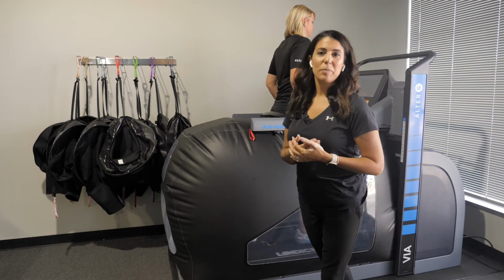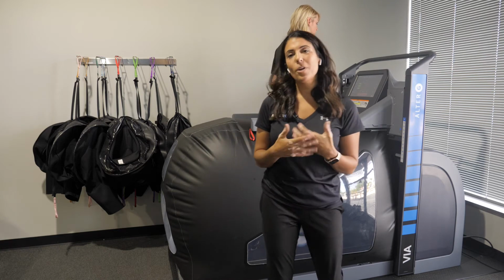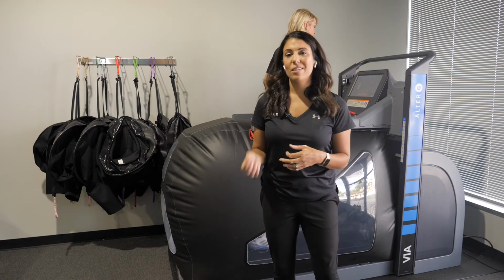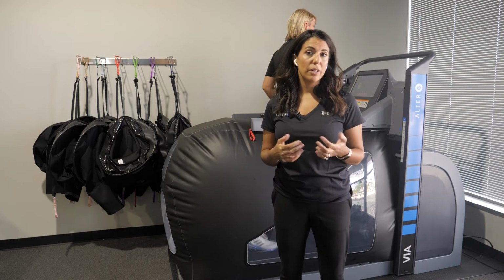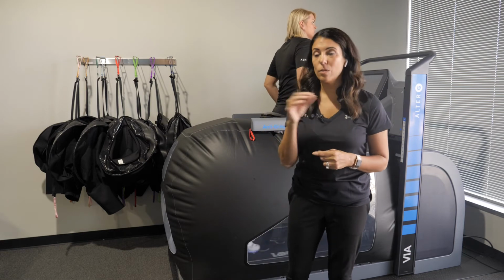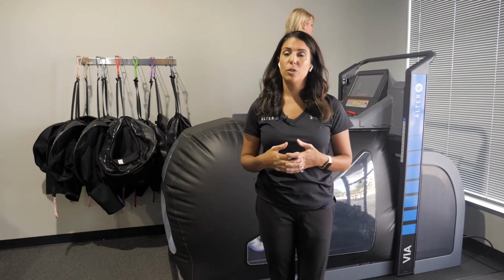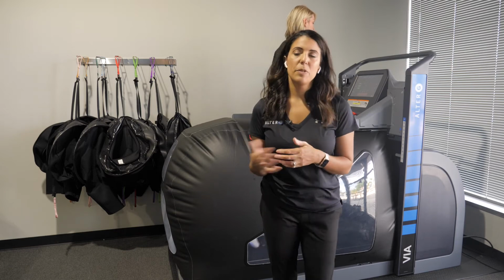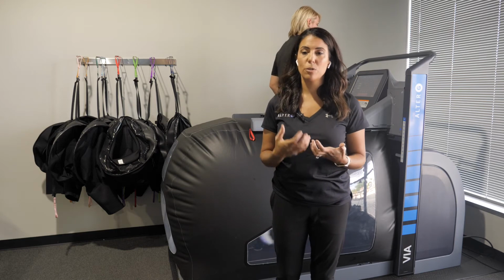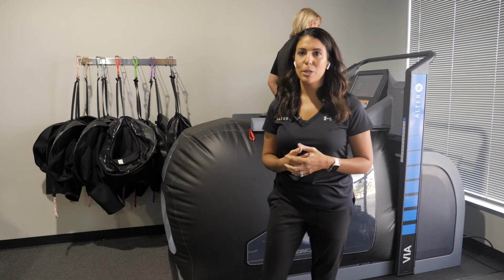I want to explain a little bit about StrideSmart software while we're talking about all the technology and features of the treadmill. StrideSmart is our gait analysis software that allows us to see the direct effects of body weight support, speed, incline, duration, all the various parameters, on a patient's symmetry. We've chosen to look at temporal spatial parameters of gait, and this is because we're using load cells underneath the treadmill to gather that data. So all these measures are going to be measures of stance. There's obviously going to have to be weight bearing through the treadmill to be able to get these measures.